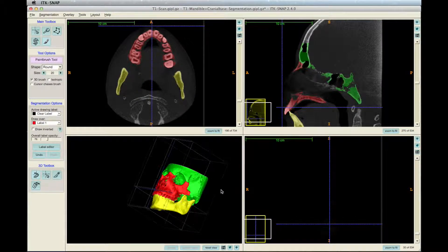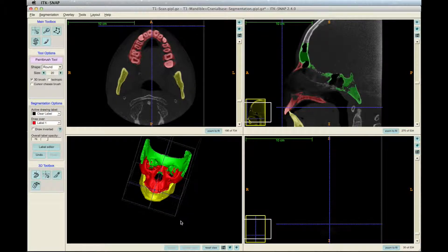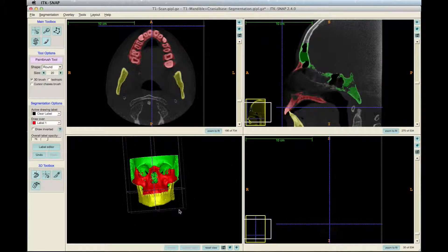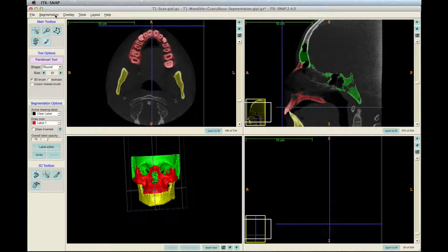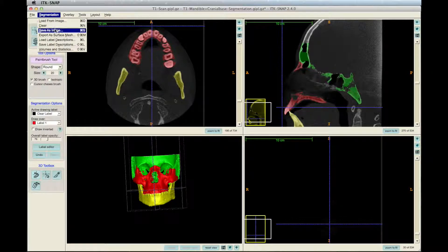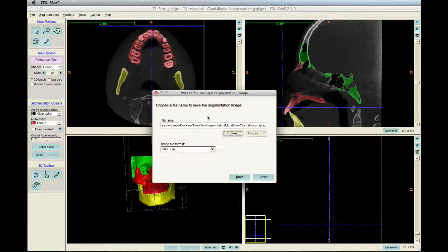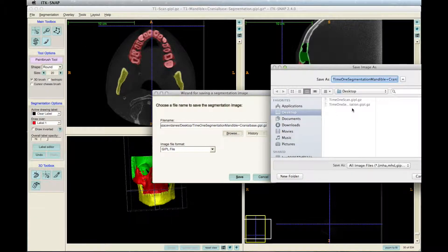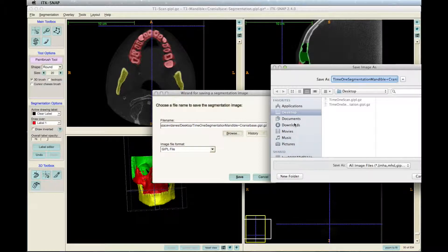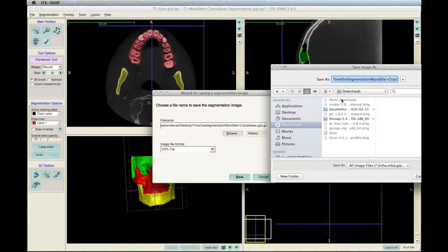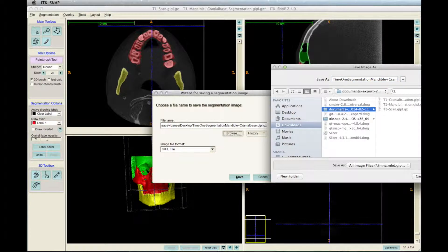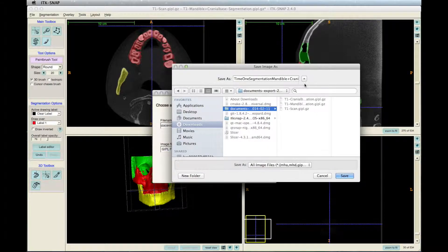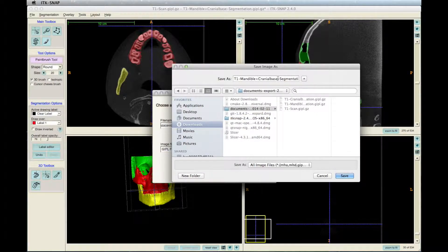When finished with all the manual adjustments, the segmentation is ready to be saved. Click Segmentation in the upper left corner and select Save As Image. Choose the directory and remember to type .gipl.gz at the end so it can be saved as a compressed file to save some space.